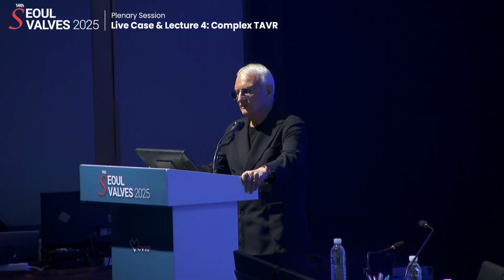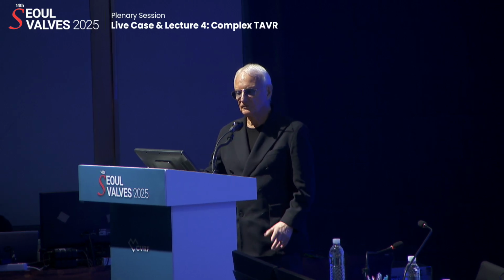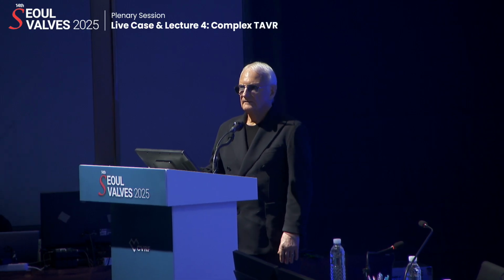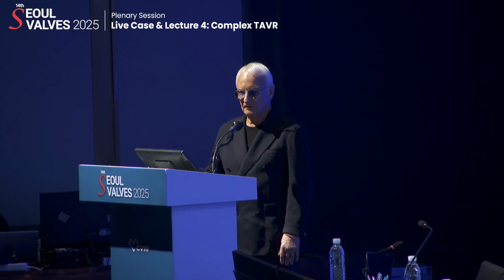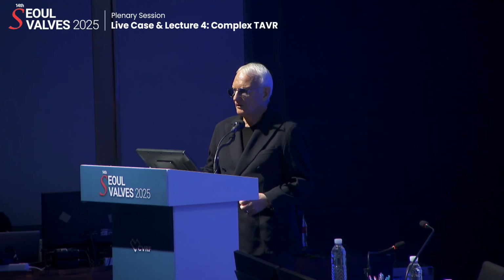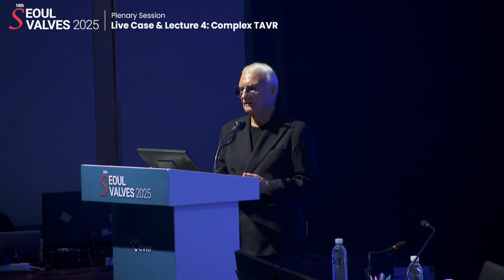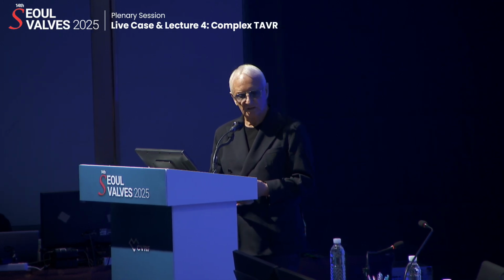Yeah, I humbly disagree with the comparison of mitral and tricuspid. I think those are two different animals. I think the mitral valve is different from the tricuspid valve in many ways. And I believe that in the mitral space, there's not much that we can say, it's basically only TEER. And now we have more experience with TEER and we see more patients coming back. We know that. And I always said that TEER is a very, very safe procedure. And that is a blessing and a curse.